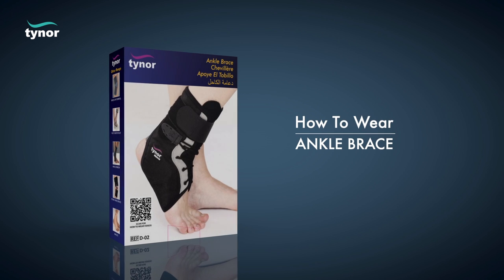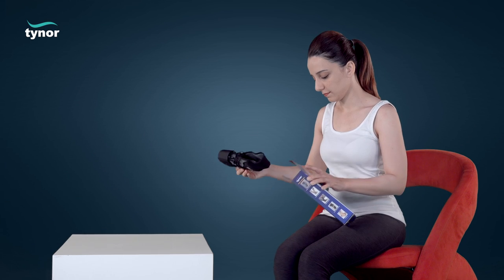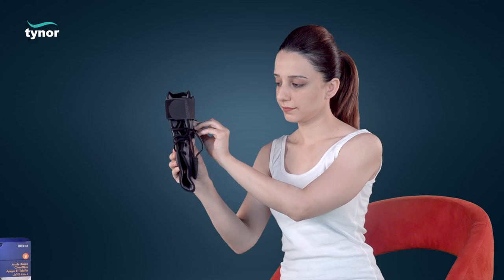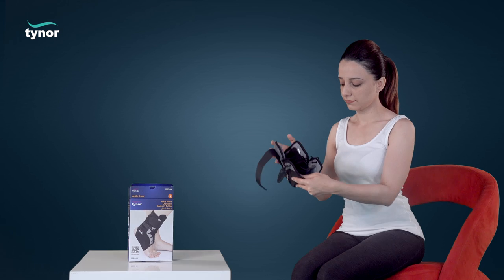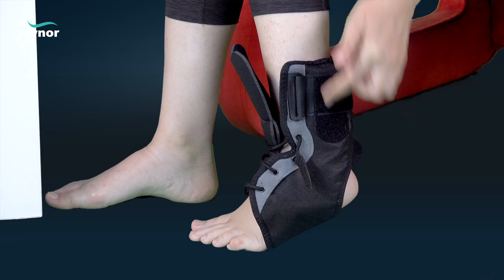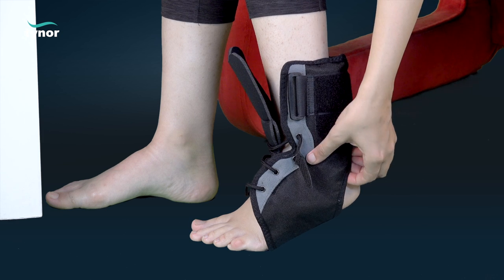Now let us see how to wear the ankle brace. Unfasten the hook loops and check for the 'up' sign. Slide the foot to wear the product so that the heel fits snugly into the heel opening.